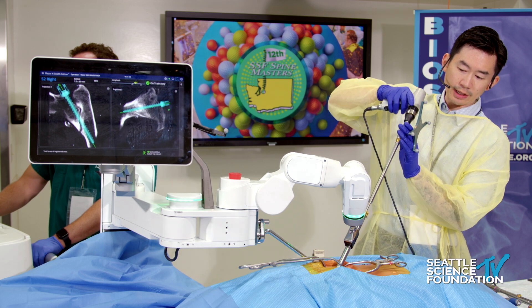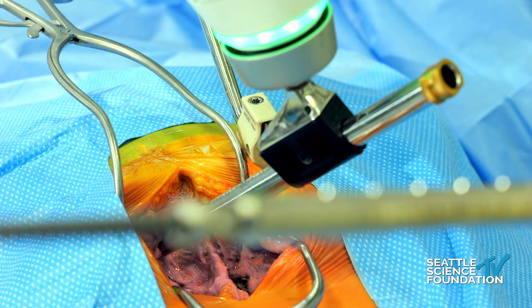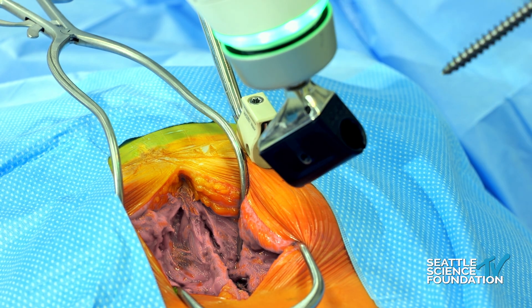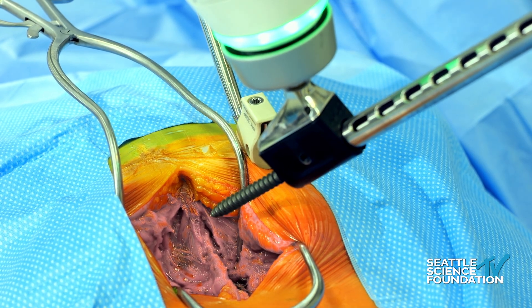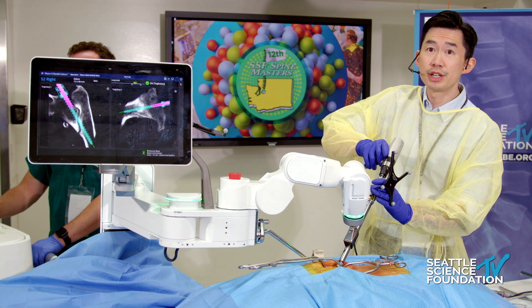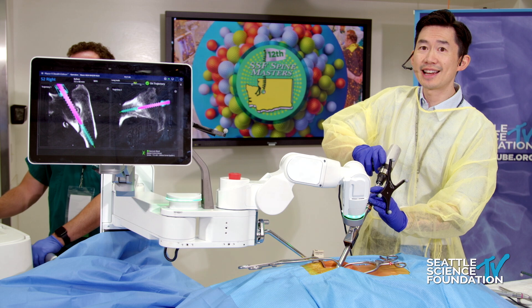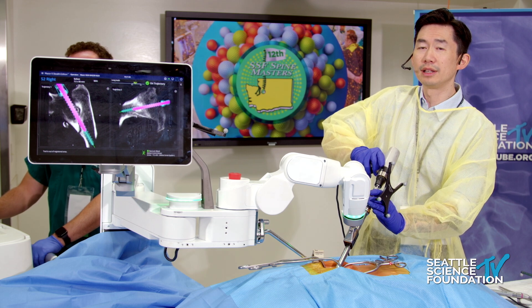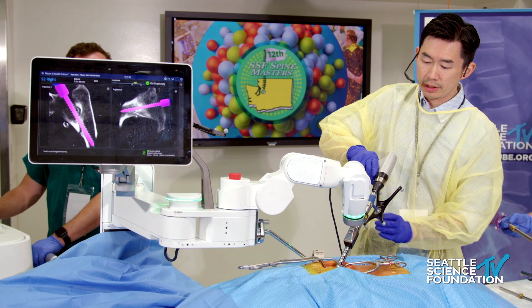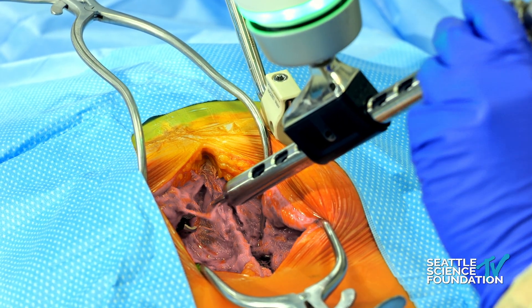The last step is the screw itself. I do everything on power — for surgeon longevity, power is really the way to go to ensure everything is in line with a smooth delivery of force. You can see here the guidance of the robotic arm during screw placement. It seems almost mundane and straightforward, which really is a testament to how robotics handles what was essentially a very difficult screw. Now you can place this screw, detach the drivers, and move on with the rest of the surgery.